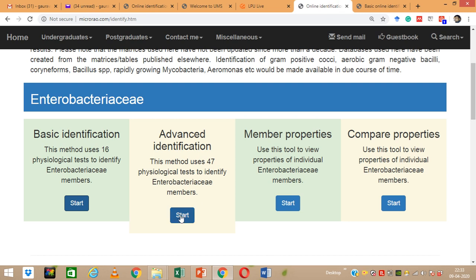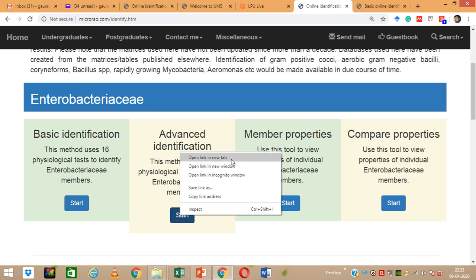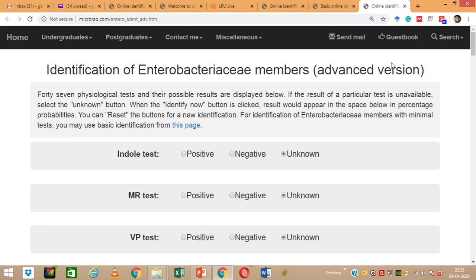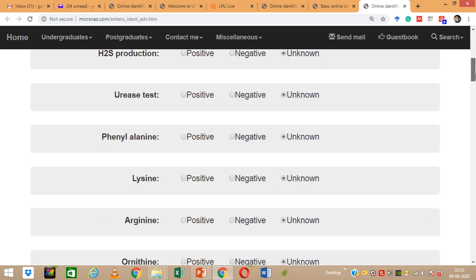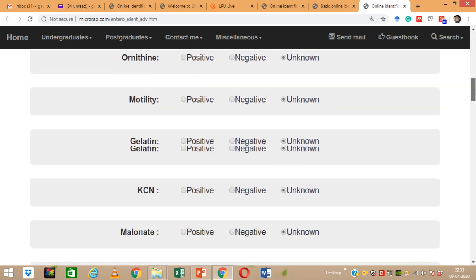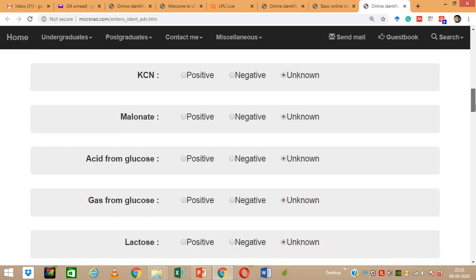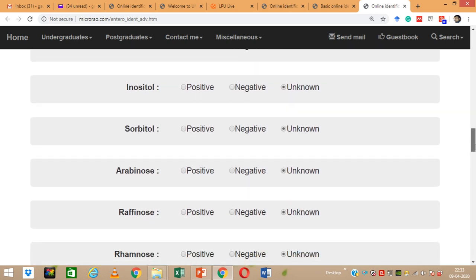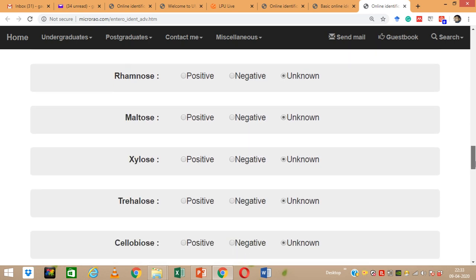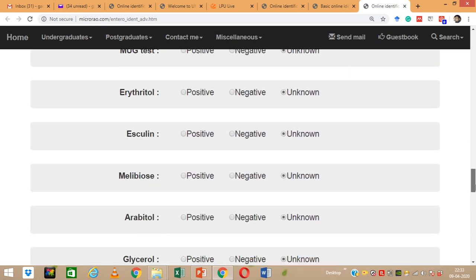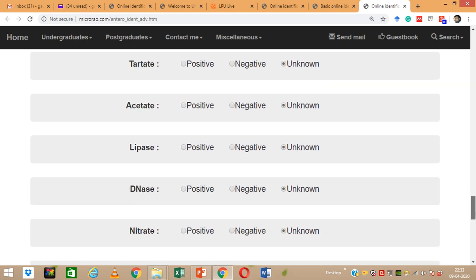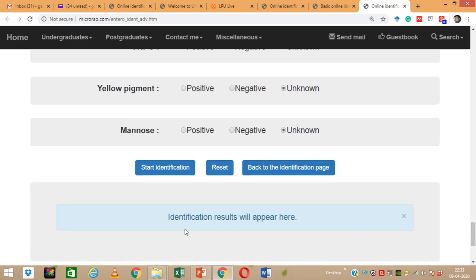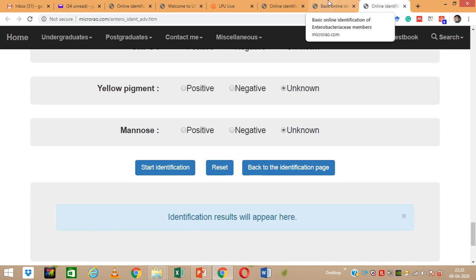If I select the advanced identification option, we get a much higher number of biochemical tests and other test options. So if you are unable to identify using the basic identification system, you can perform many more experiments, fill in the data, click start identification, and get a more refined list of organisms. It is the advanced form of basic identification.